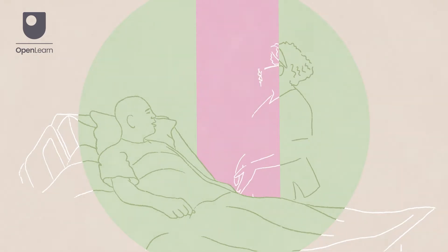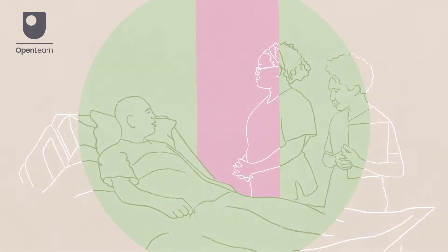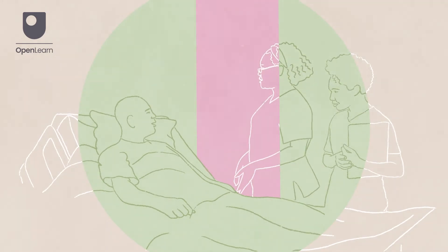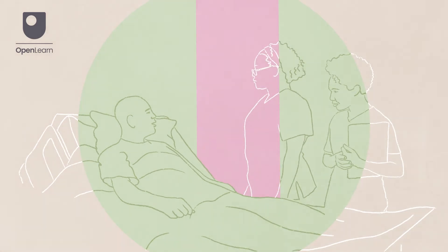As a healthcare student it is useful for you to have a thorough understanding of the steps involved in this procedure. Introduce yourself and check you have the correct patient. Explain the procedure to the patient and check they have understood. Ask for the patient's consent prior to proceeding.